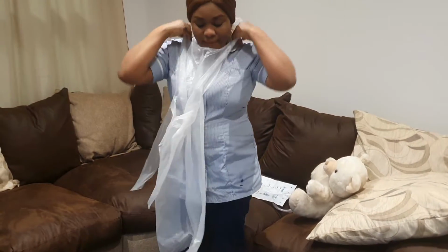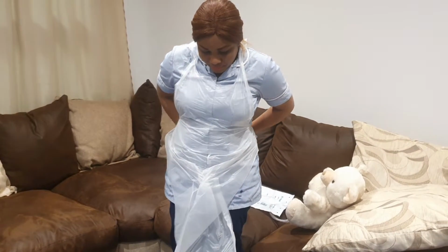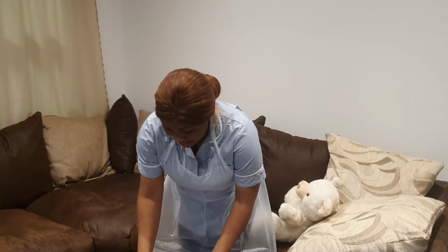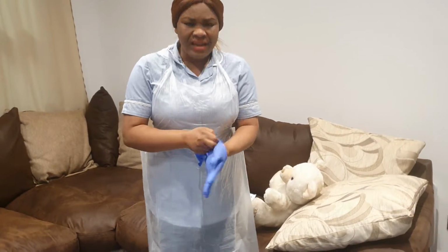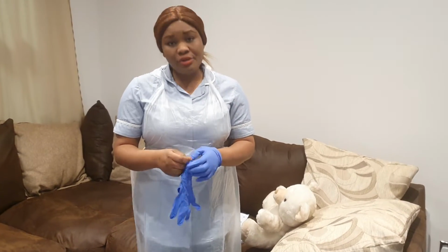So I'm just putting on my apron and my glove. Guys, this is a very important point. Make sure you validate your equipment. Failure to validate your equipment can actually lead to a fail in your OSCE exam. Validate your equipment. Really important. Please don't forget this in your OSCE exam.